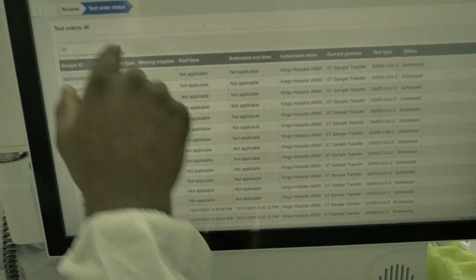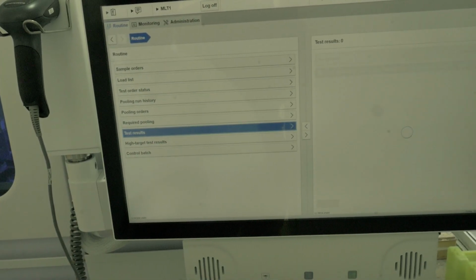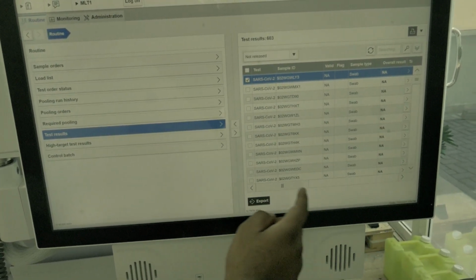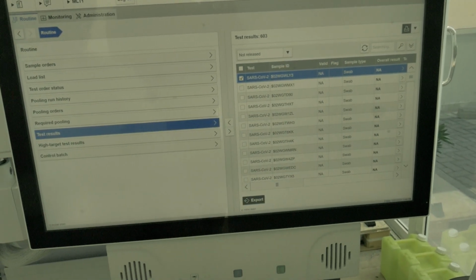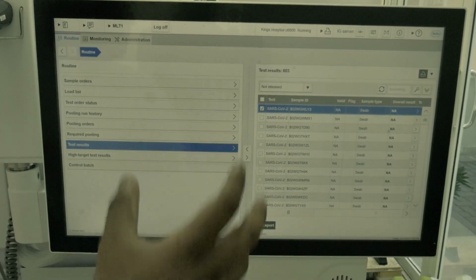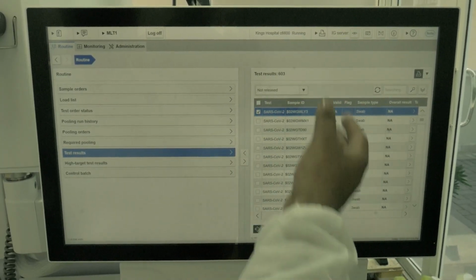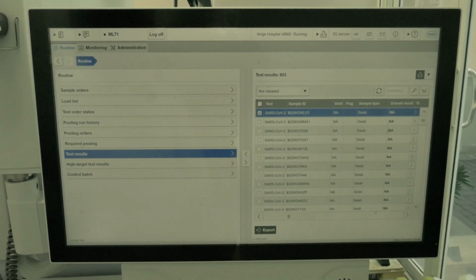So at the end of the day, the test results will be available, and you will know whether it's positive or negative. So very simple. Everything is there. All you need to do is mark, and then we are in the process of integrating this into the computer where you don't have to worry at all, but we're still relying on paper-based. So at the end of the day, we'll take a printout and we'll know which sample is what, and at the end of the day we can get the results.